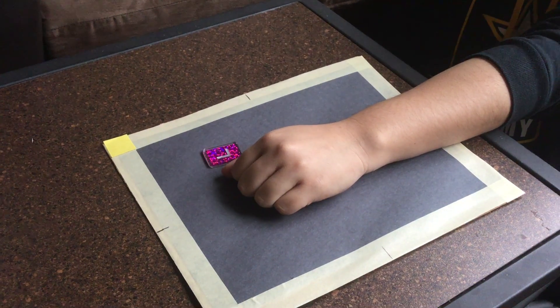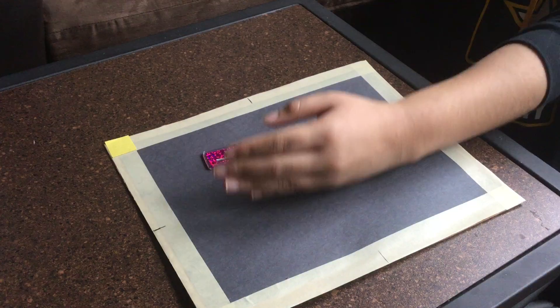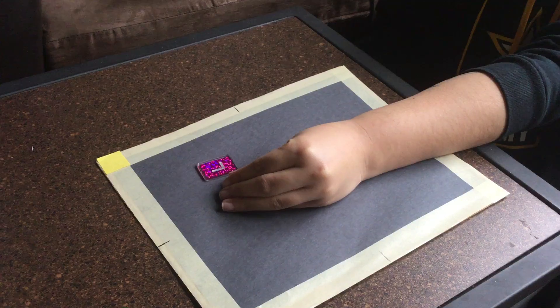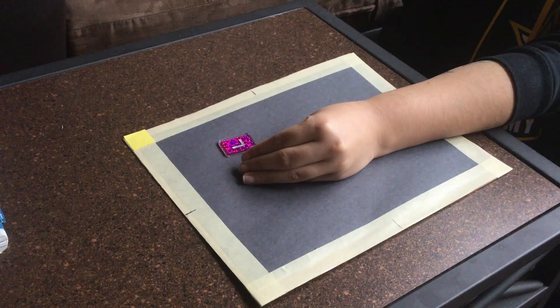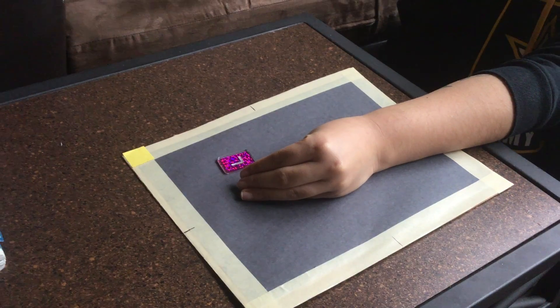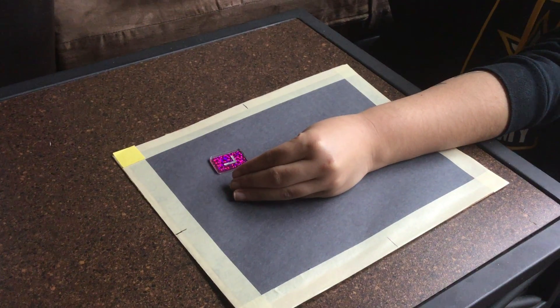So now we're going to be doing the oblique wrist. We're going to place our hand like this. So the central ray is going to be going through the distal radius and the collimation is going to be around the carpals.